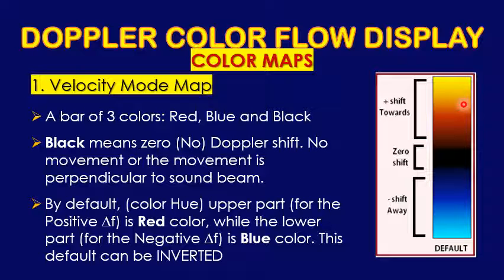But some people might feel that it's better to have an artery in red. Okay, no worries. If you have the vein in blue, it also doesn't make any difference, but keep in mind that you refer to the color map that will explain to you the meaning of this flow. Is it away or towards?